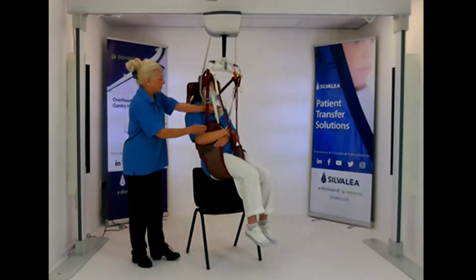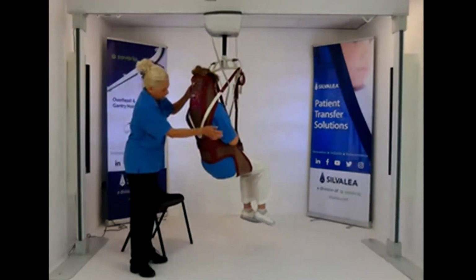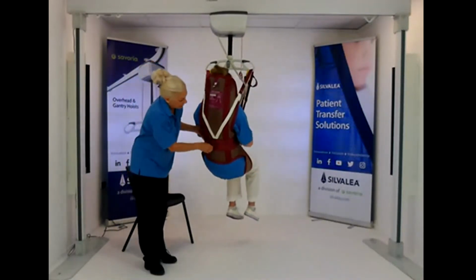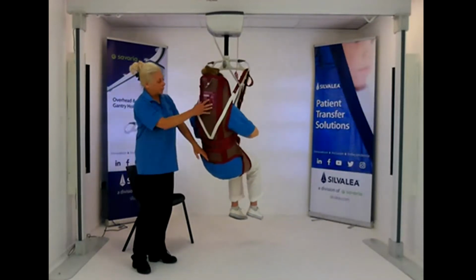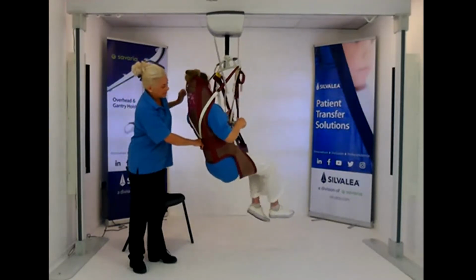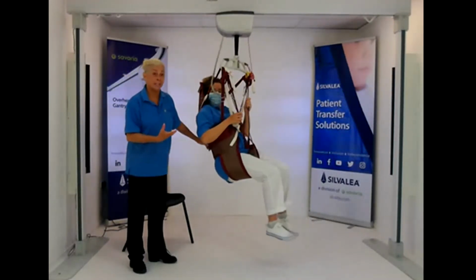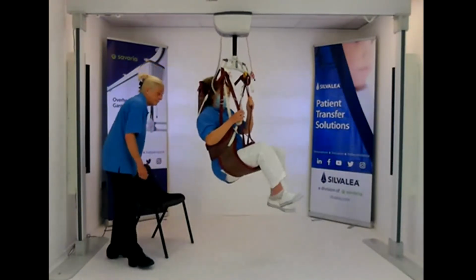So if we now just look at the sling on, you can see the belt line here. So we can see that we can get to clothing if we need to do a hygiene transfer. You can see around here it's hugging Laura's trunk and giving good back support. So if you can just push it back. If she tries to extend, are you trying? Yeah. It's flowing, it's going with her, it's keeping her supported. Can you sort of pull through it? Okay, bring your knees up.